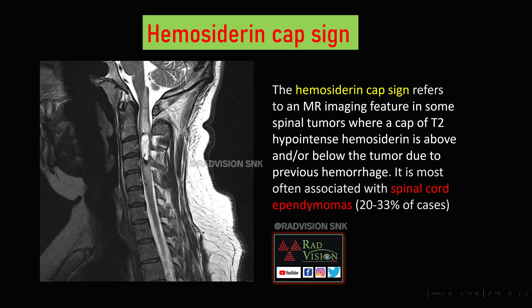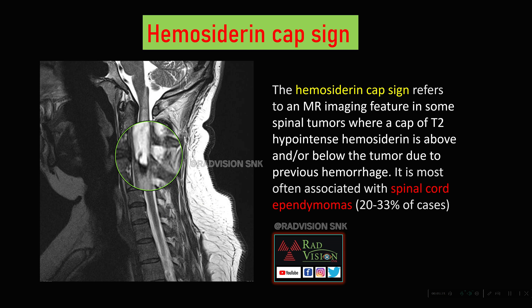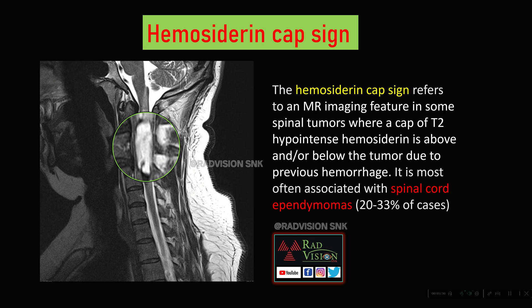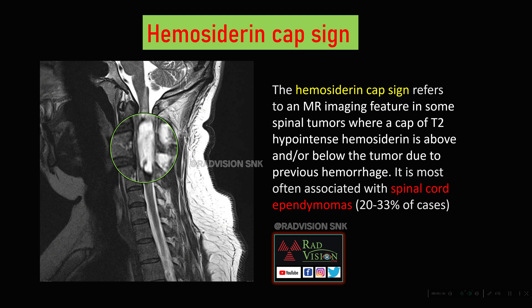Next is the Hemosiderin Cap Sign. On MR imaging, on the T2-weighted image, there is a hyperintense lesion in the spinal cord at C2-C3 vertebral level, with a hypointense rim or cap seen above and below the tumor. This hypointense cap is the hemosiderin rim or cap, due to chronic hemorrhage above and below the tumor from previous hemorrhage. It is classically seen in spinal cord ependymomas in 20 to 33 percent of cases. The Hemosiderin Cap Sign can also be seen in spinal cord cavernomas.